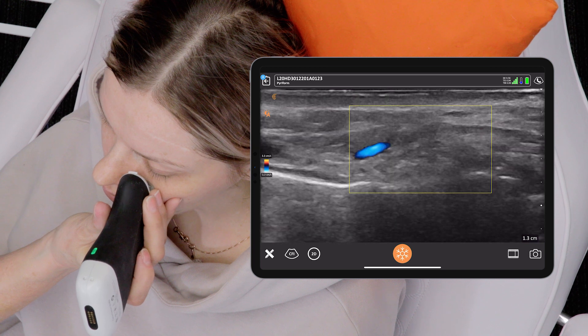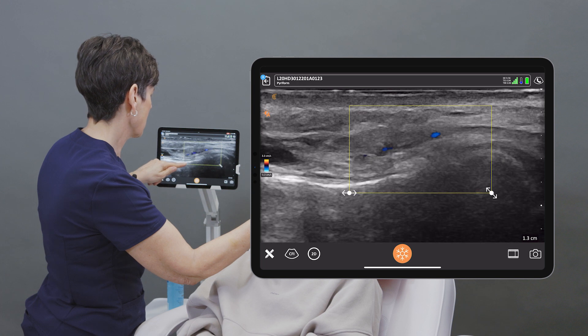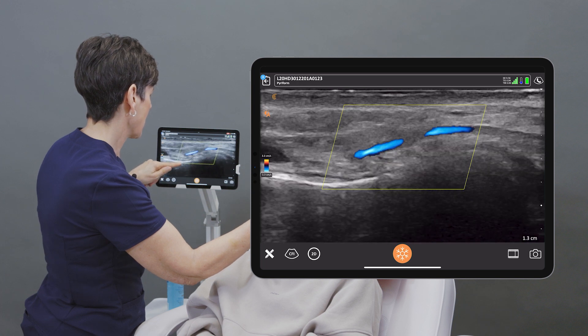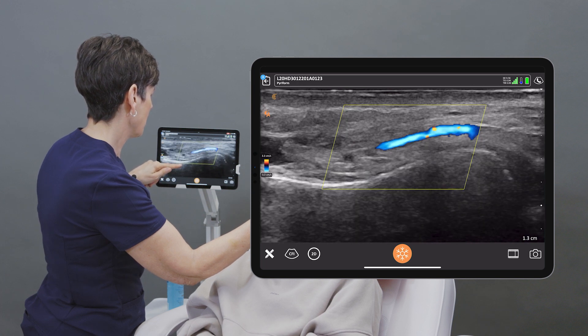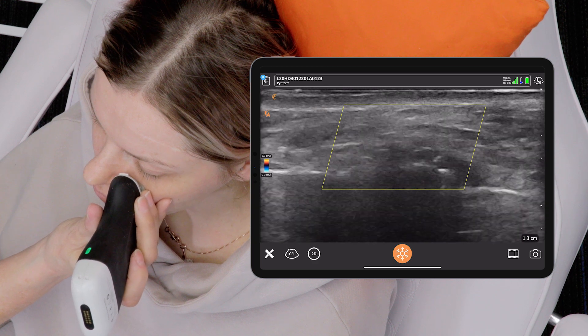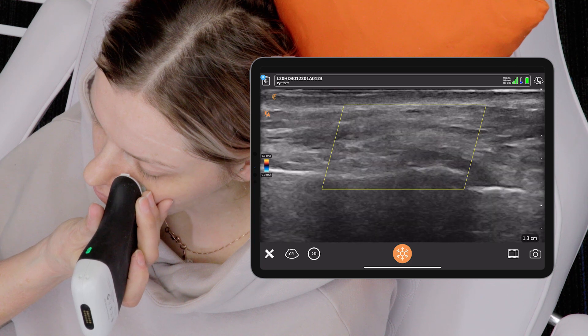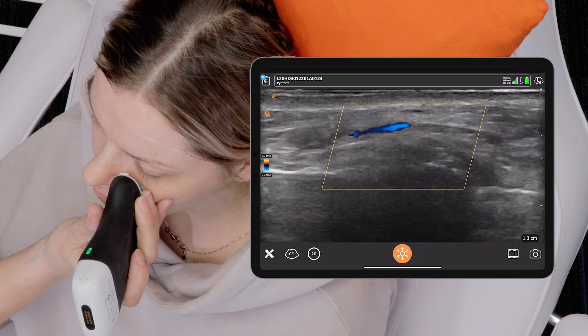Now if I want a little bit more color sensitivity within that vessel, I can steer the color box in the direction of the blood flow. Now if I just move a little tiny bit, we can see the vessel is coursing now away from the scanner but I'm not getting any color there.